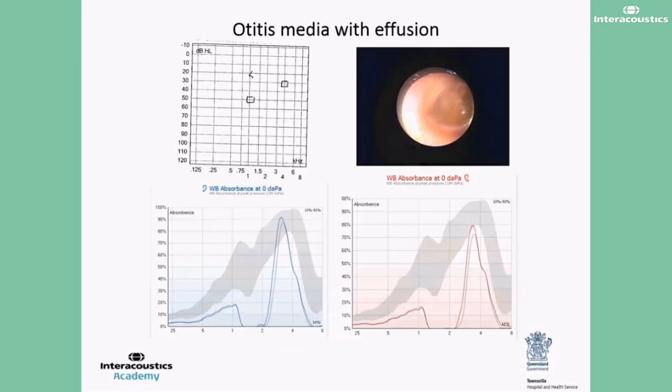Now, ambient and pressurized conditions are affected in a similar way with otitis media with effusion. Animal and human studies have shown that absorbance generally decreases as the fluid fills the middle ear cavity, and more significantly after about 50% of the cavity is filled with fluid. This effect is seen mostly below the 3 kHz region. The absorbance in high frequencies changes less as fluid replaces air.